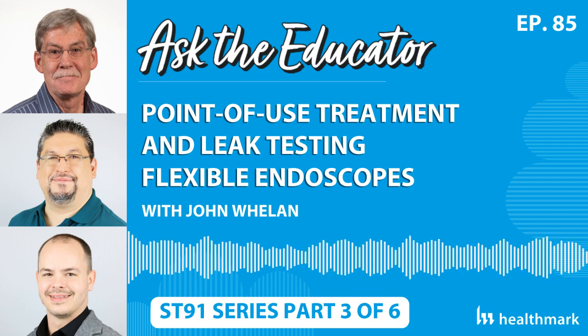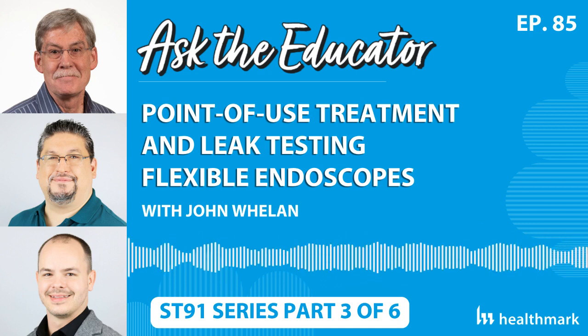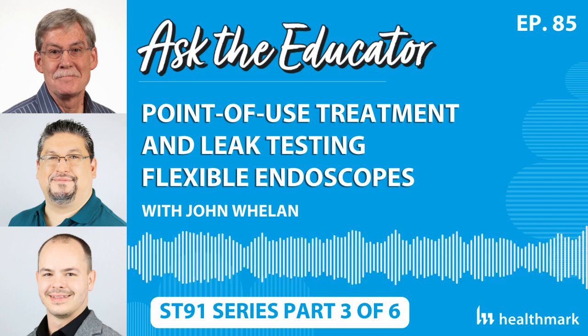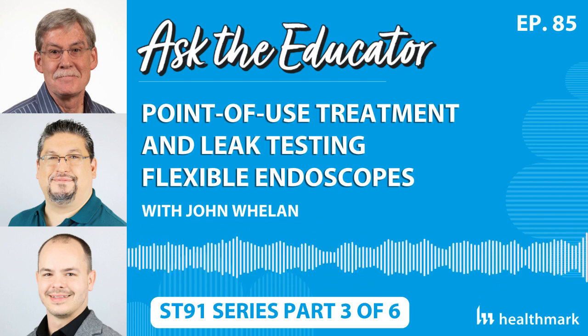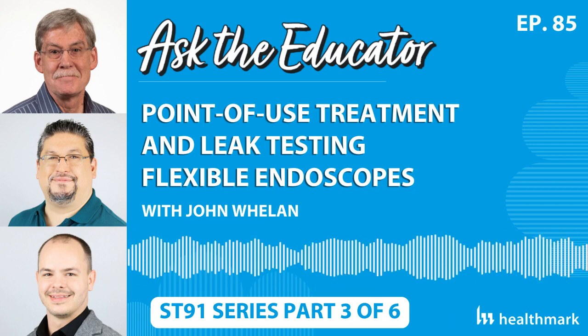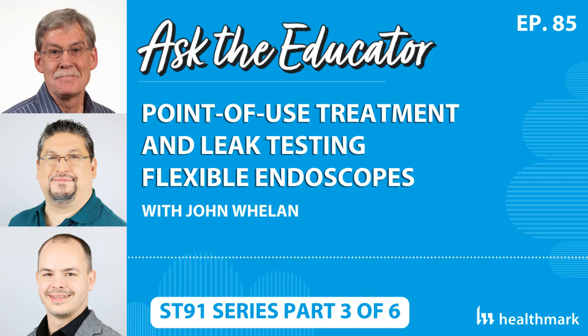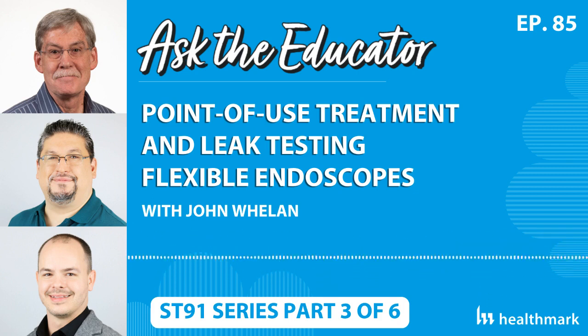That's not appropriate, but it was what our clinical engineers did because there wasn't a commercial option available. But I can guarantee you Olympus would not recognize that as an acceptable way of modifying their device. So that's why I wanted to make sure that people out there are aware that there are now devices available for such leak tester testing, if you will.